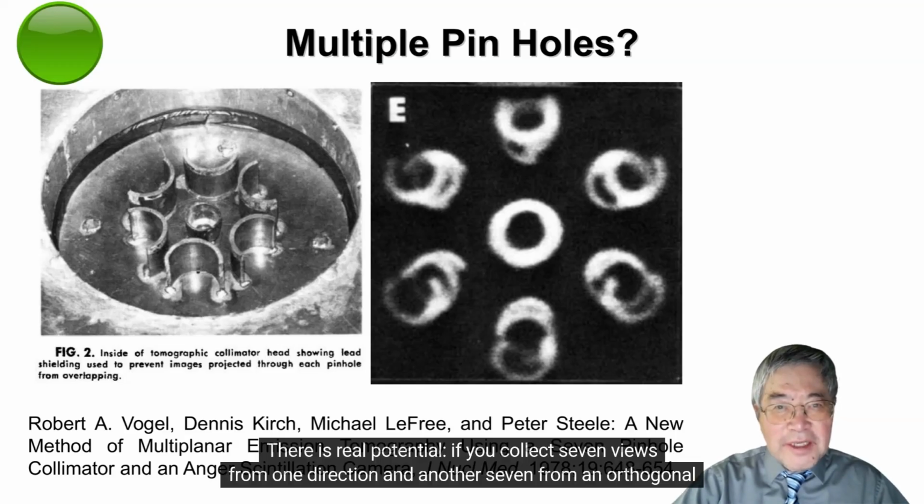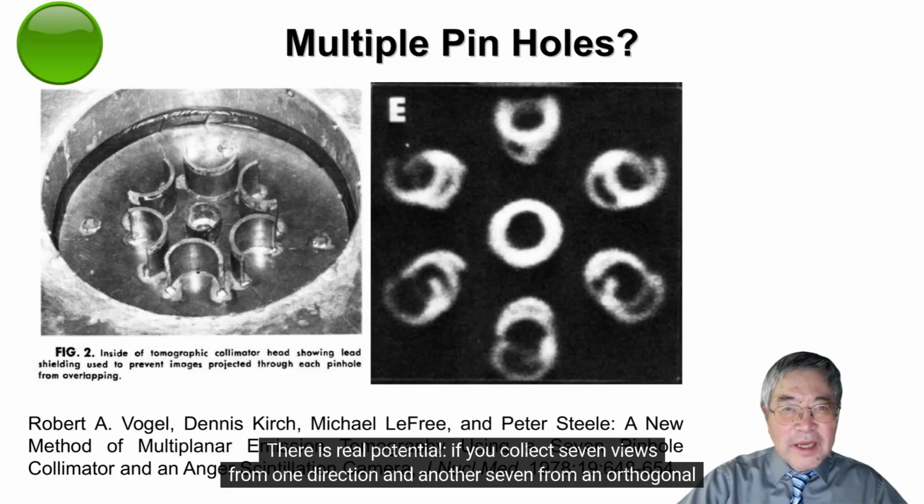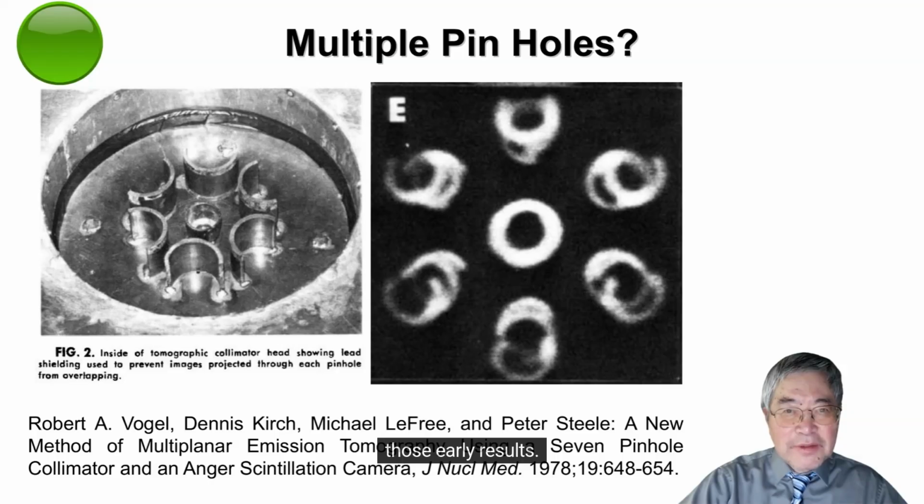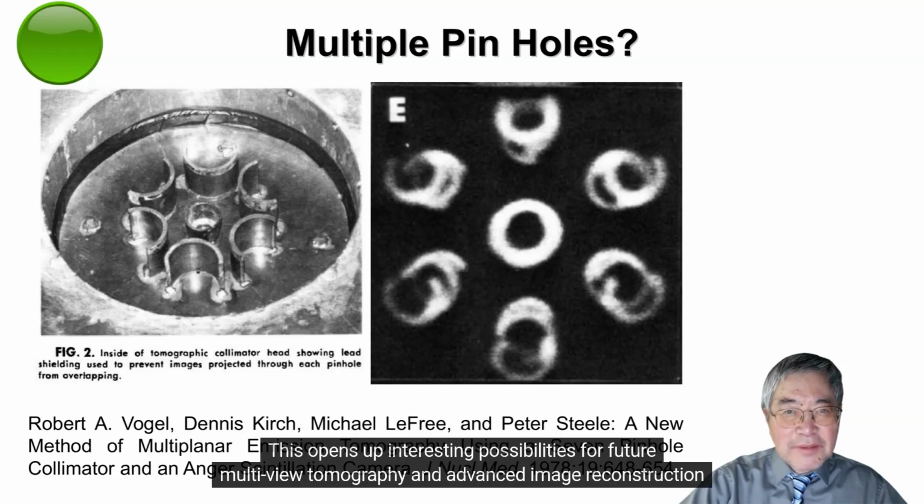There is real potential. If you collect 7 views from one direction and another 7 from an orthogonal direction, then with modern signal processing, you may achieve image reconstructions far superior to those early results. This opens up interesting possibilities for future multi-view tomography and advanced image reconstruction techniques.